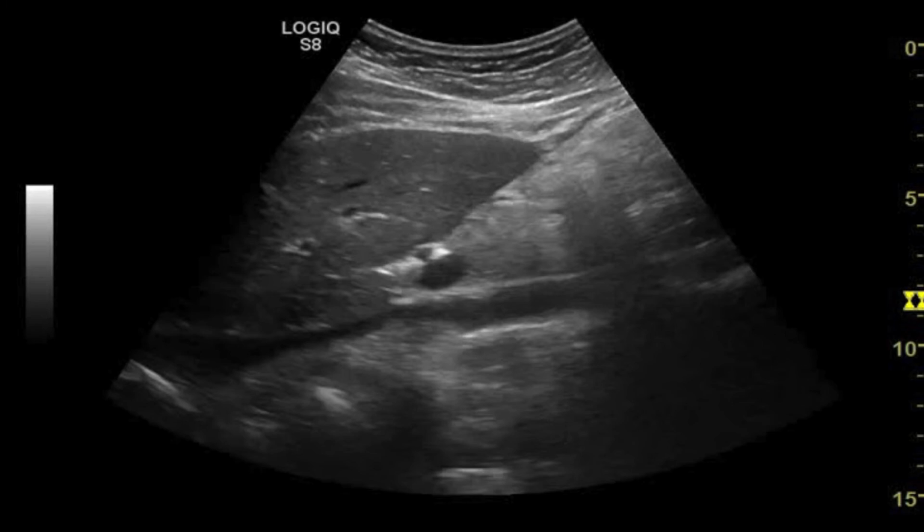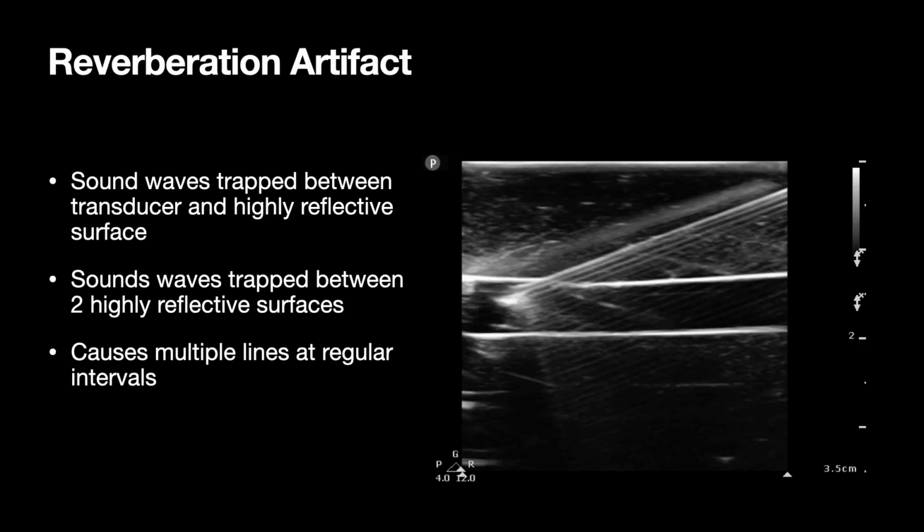So underneath the liver margin here, we have the loops of bowel, right? And so air is going to appear as this hyperechoic line, with this grayed out, staticky shadow that just really doesn't have a shape, but it covers everything up that's underneath it.